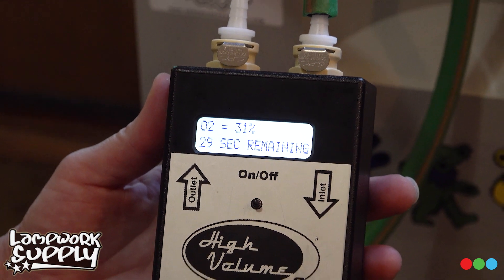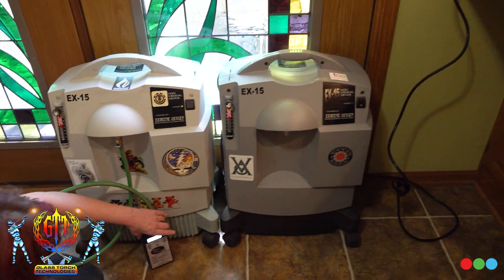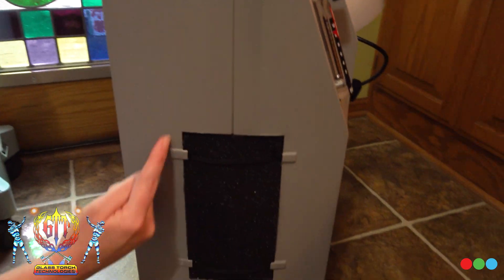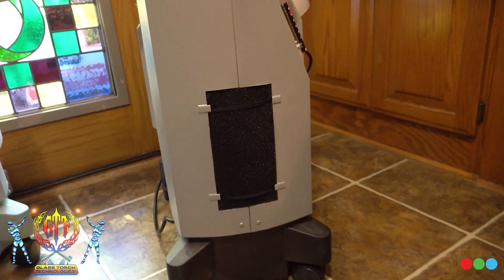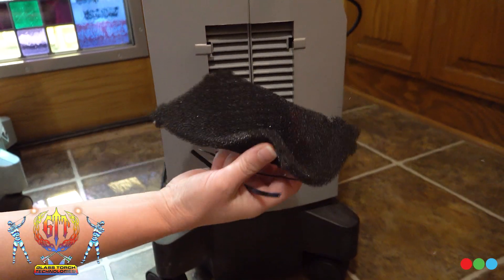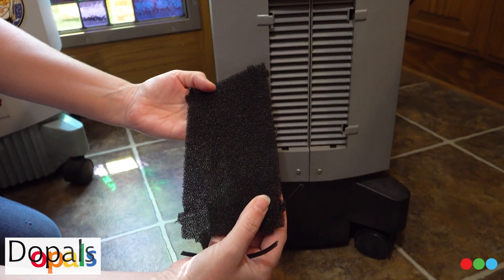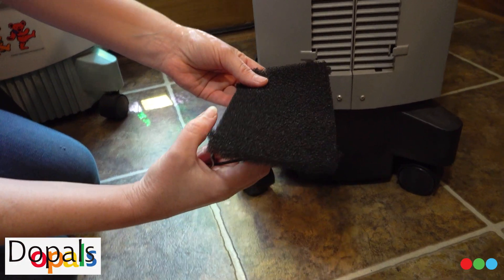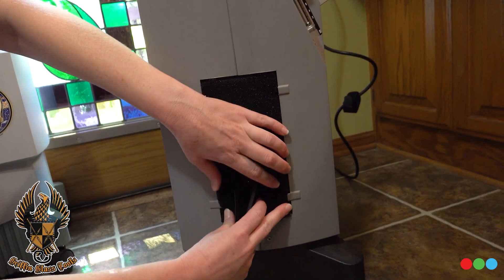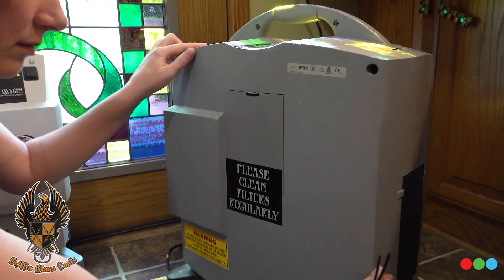Now we'll put that down for a moment and show you some really simple maintenance. This is your filter on the side — really important to keep that clean. They're usually held in with a couple of straps and you can pull it out. You can give it a quick beat-out. At a certain point though those things will just cake up. There's also another filter in the back that's important to keep an eye on.